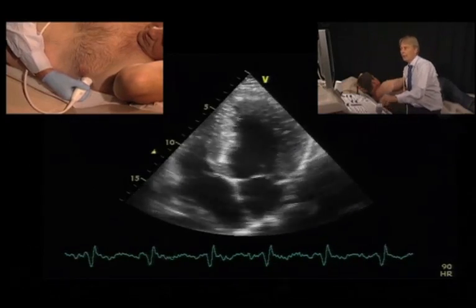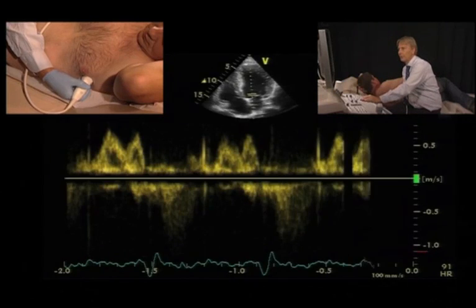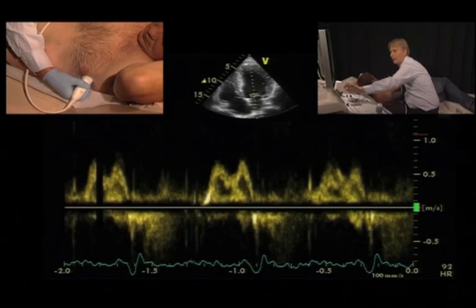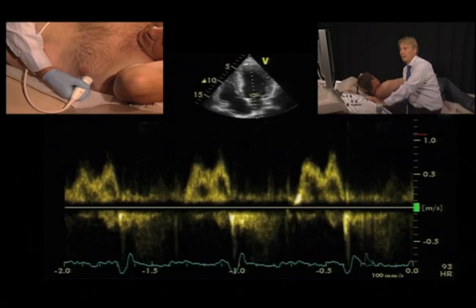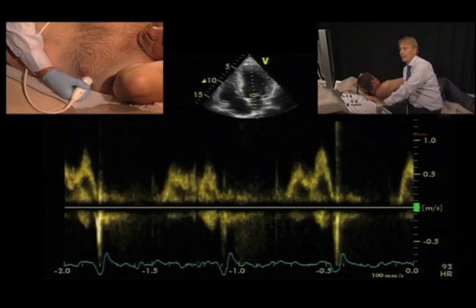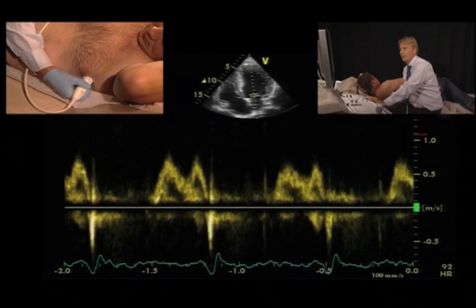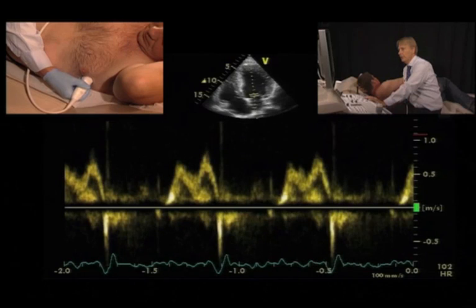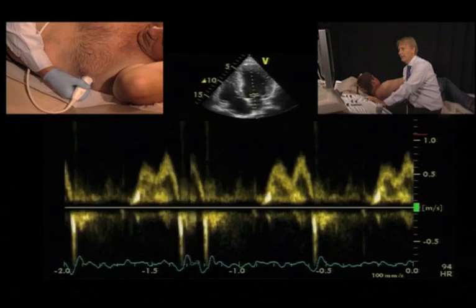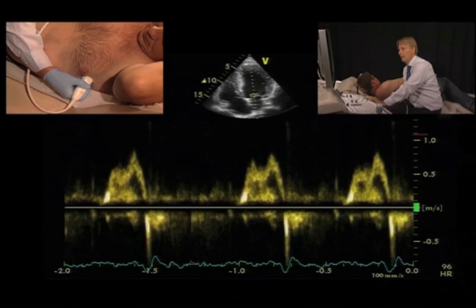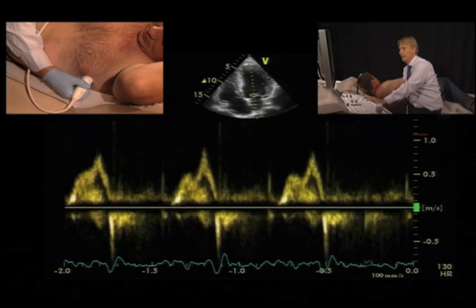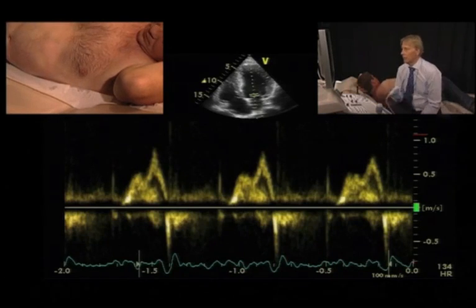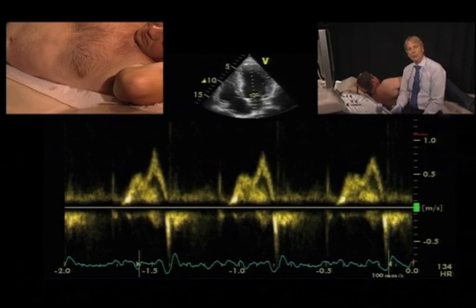There's another way of looking at it. Let's take a look at the pulsed-wave Doppler signal again. We see that E and A are about the same size. Now let's have him perform a Valsalva maneuver — and with the Valsalva maneuver, the A wave increases more and more. All of a sudden we have a relaxation pattern, thereby unmasking the pseudonormal pattern and showing that the patient does not have normal but elevated left atrial filling pressure.